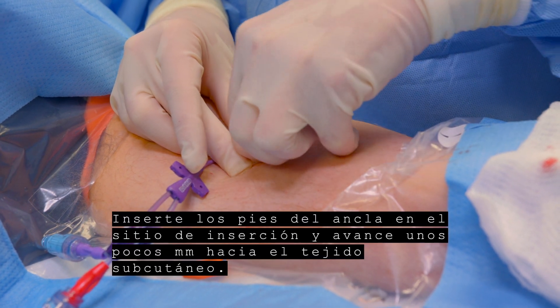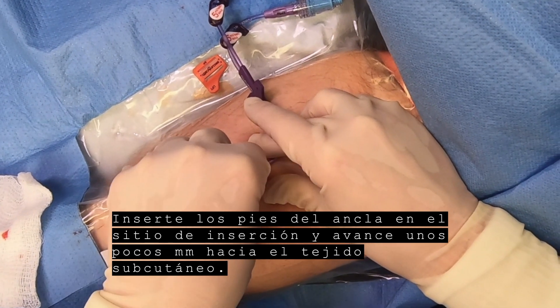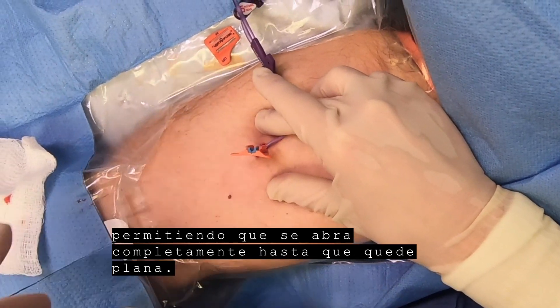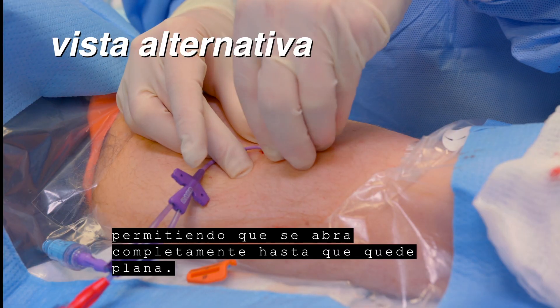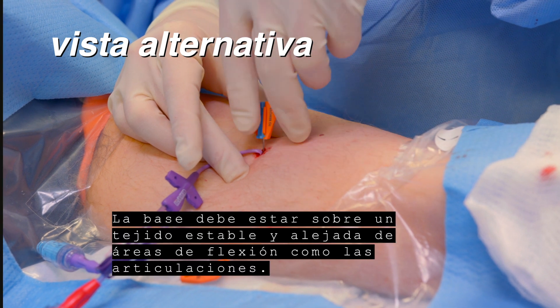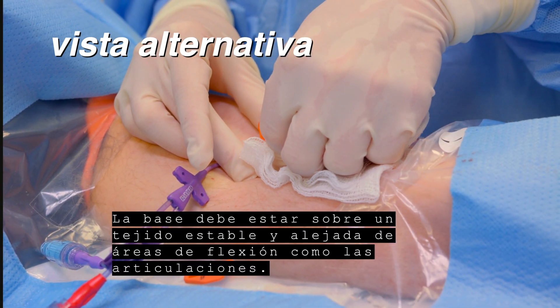Insert the feet into the insertion site and advance a few mm into the subcutaneous tissue. Turn the SecuraCath to the desired indwelling orientation. Release the SecuraCath base, allowing it to fully open until flat. The base should lie on stable tissue and away from areas of flexion such as joints.